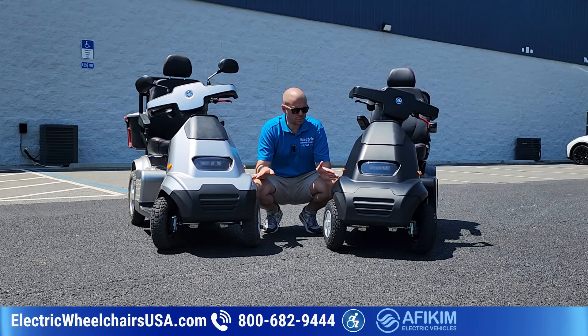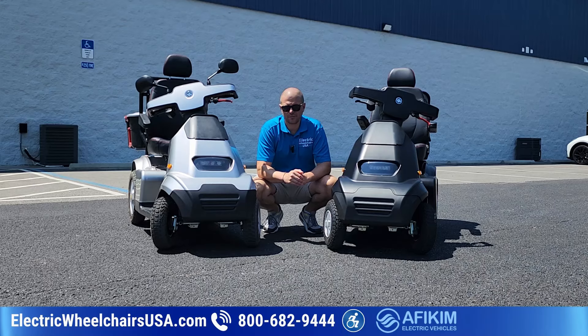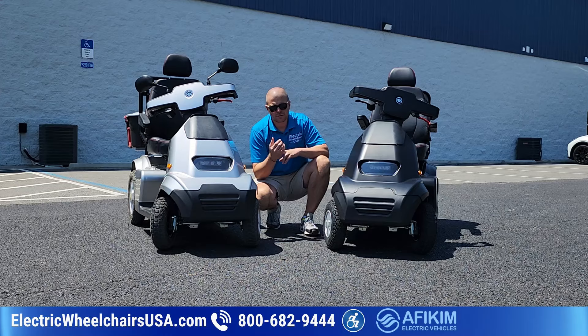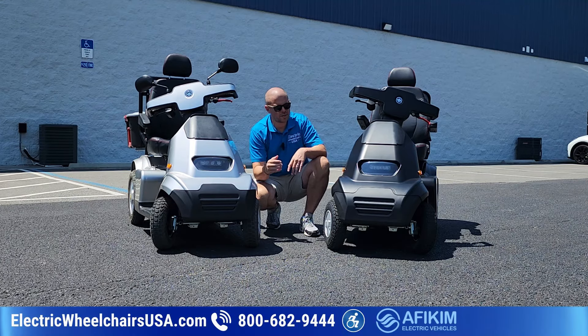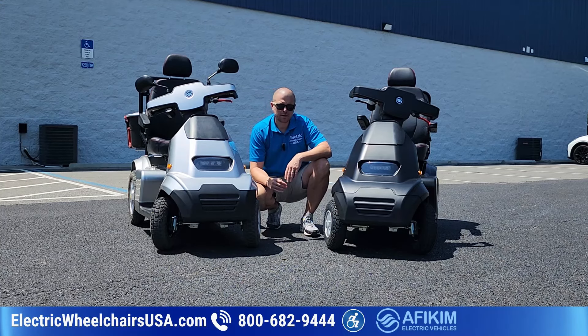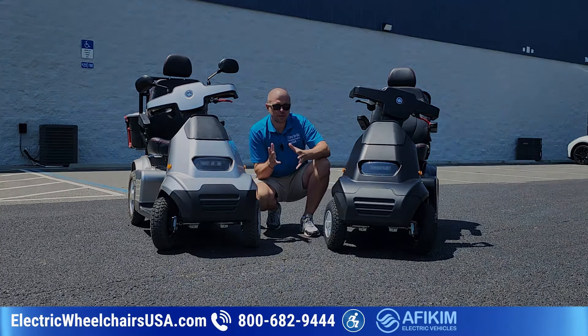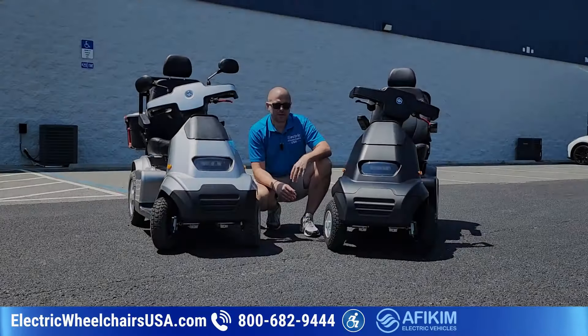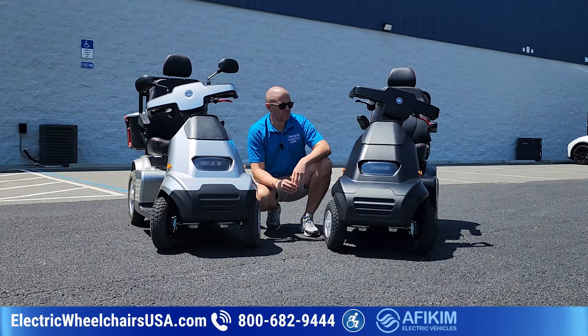Let's get into it and show you some of the awesome features of the S4 by Afkim. The S models and the C models all have different color options — they all come in silver, red, blue, or gray. But with the S4, there is now a matte black color, which is what we have here. It's new to the market, and not many dealers can offer this color, but Electric Wheelchairs USA can. It has a really nice finish to it.